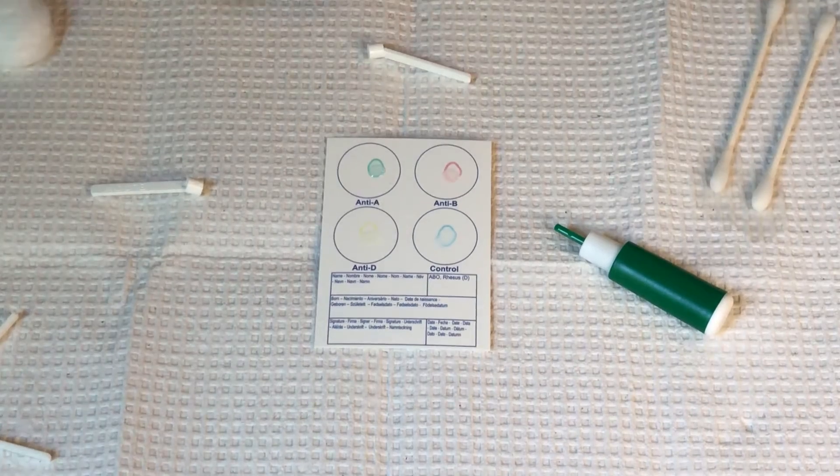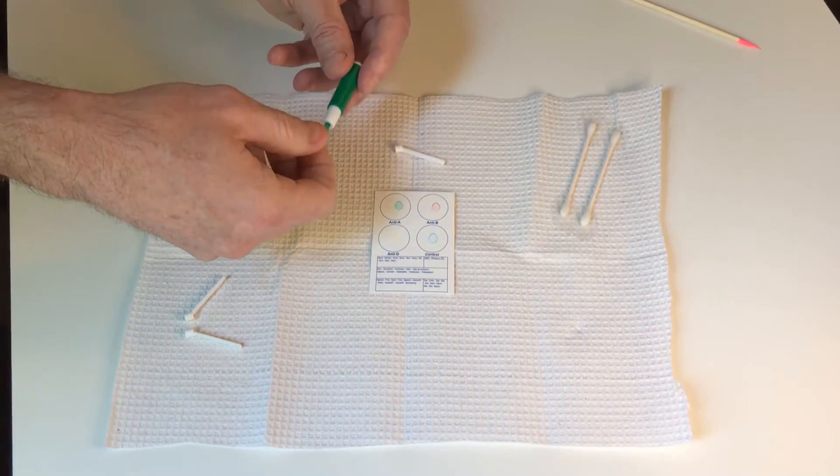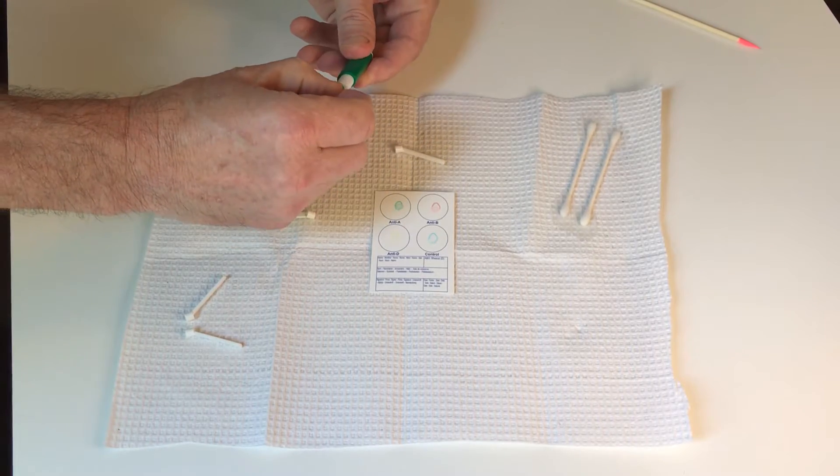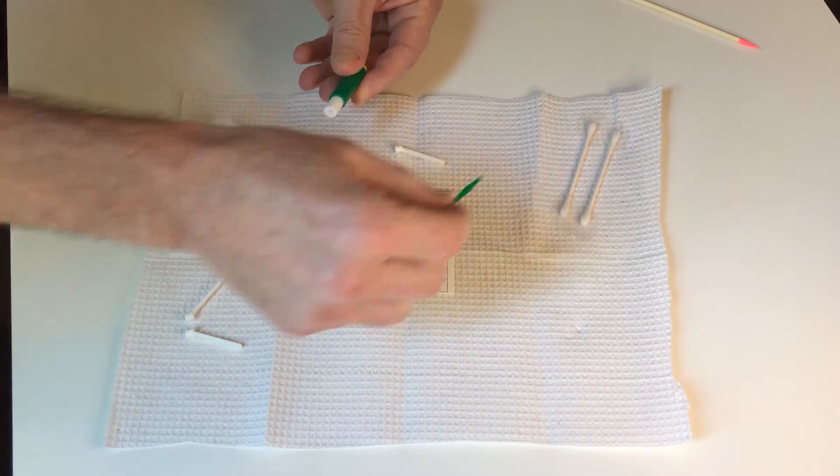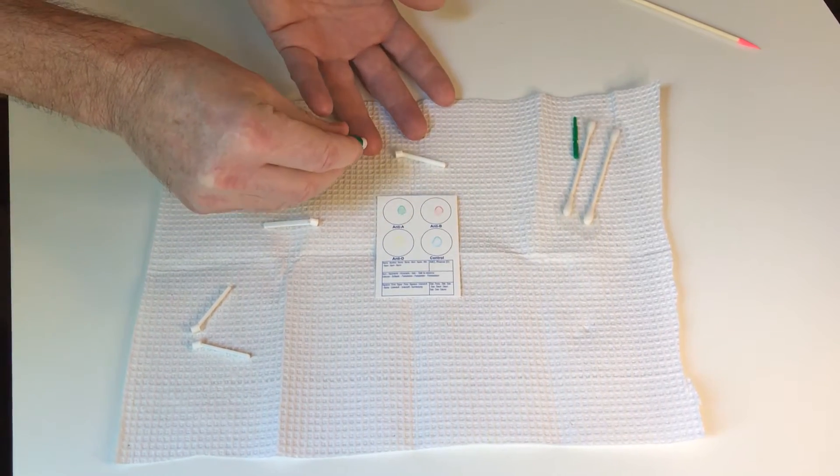I've already rubbed my finger and cleaned it and washed it. Here I have a little poker. I'm just going to twist that, pull it out, place my finger on the table and give it a poke.